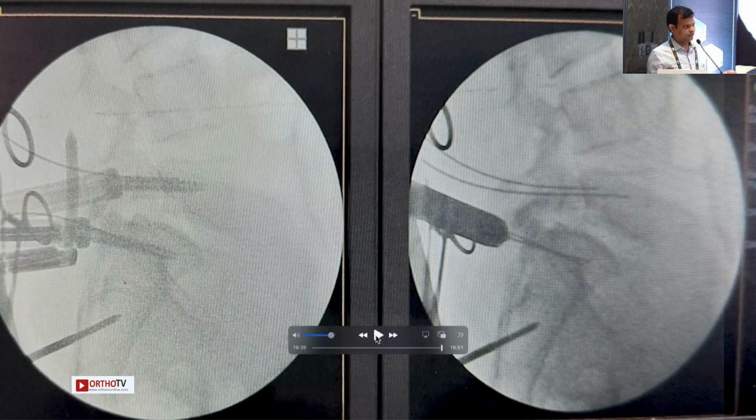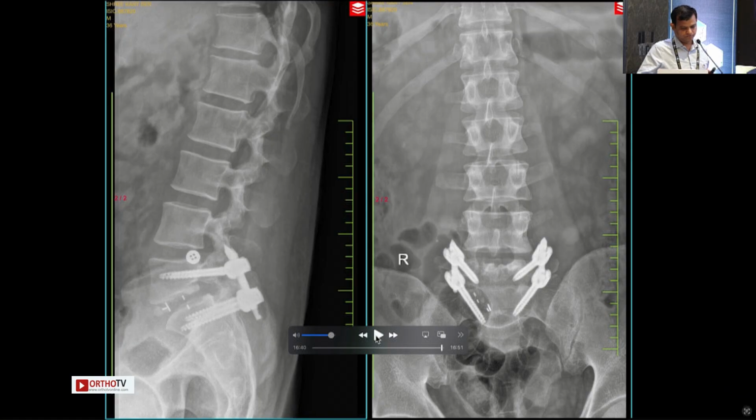Usually it is right. But as a surgeon, because that visual feedback is not giving you the right direction or the right perception, you always tend to re-register and do it properly. I found an issue with the nav, in the sense that how you face it to the camera can definitely change the rotation, because that also changes a few millimeters up and down. I hope they fix it. I think it can be fixed. It's probably just a calculation.